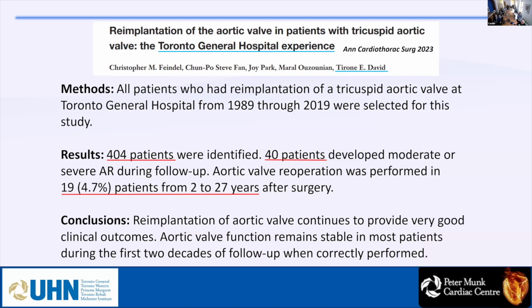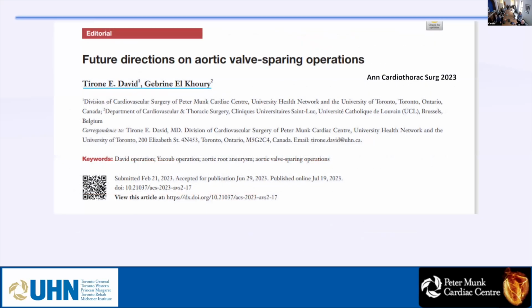So this is one of Dr. David's last papers, 2023, and he showed in 404 patients that he did, with 27 years follow-up, 40 of them had a severe AI, and only 4.7% had a redo in 27 years, okay? And these are two very good papers for echo people, especially for our fellows, that showed the way that I am doing it. So not all of this I'm doing because I didn't publish.